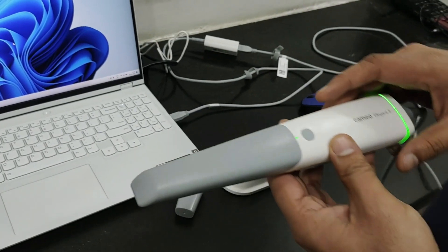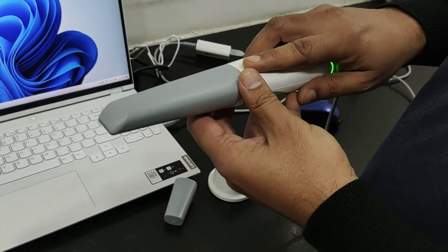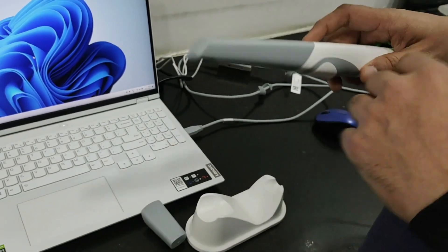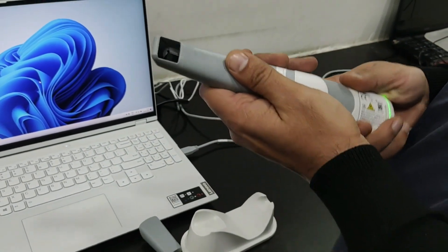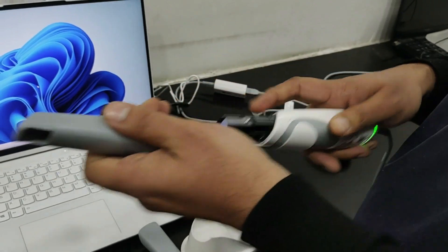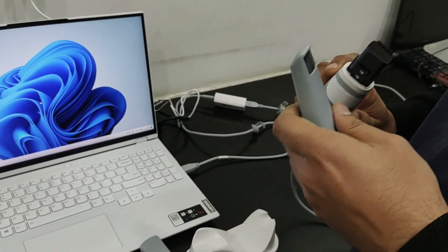The advantage of this scanner is that it is very lightweight and it has a single button. Once you keep it on the stand, it automatically pauses, and as you lift it up, it automatically restarts. You have this removable tip which you can autoclave up to 100 times, so there is no chance of cross infection.